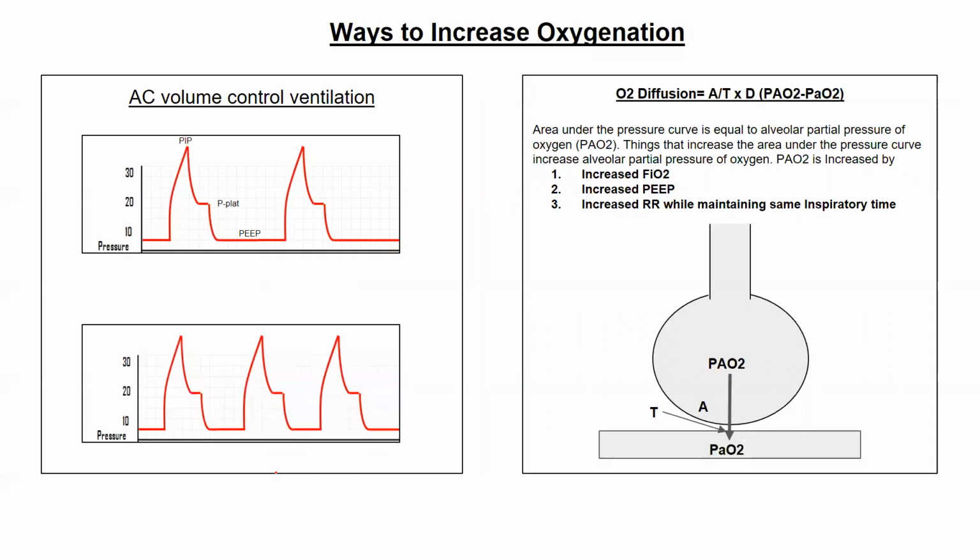So this one's hard, and you probably would never do this. I just made this a question really to teach you about inspiratory time and expiratory time. So if you guys remember, here's your pressure, here's your inspiratory time, here is your expiratory time. And here's basically where the patient's transferring from breathing in, holding, and then breathing out. All right. So what is going to happen when you maintain this inspiratory time, but then you also increase the patient's respiratory rate? Now the I:E ratio here is probably about 1 to 2.